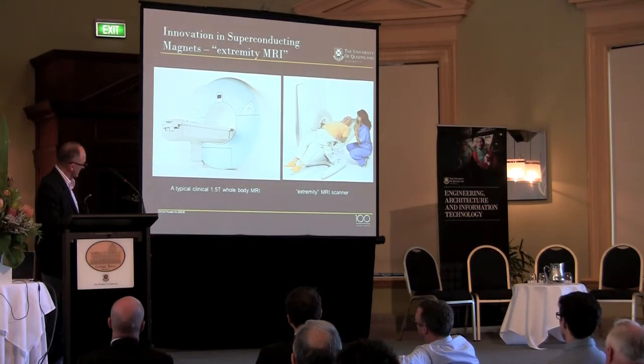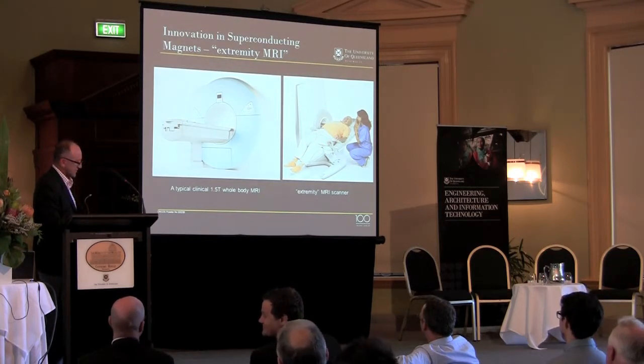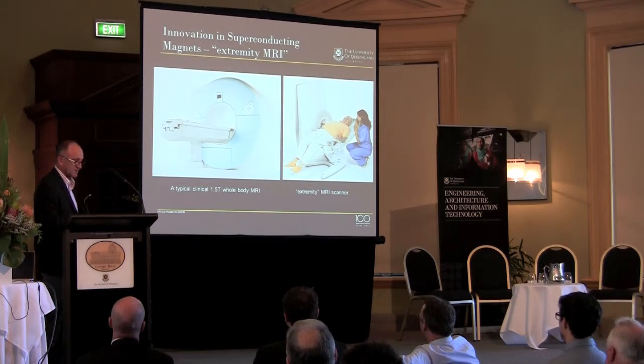So this is an extremity imaging system that images joints in the body, and you can see it's a much more pleasant experience. You get a pretty radiographer to talk to you while you're having a scan, which is always a good thing. Whereas lying in this is quite a claustrophobic and a loud experience. So we at UQ designed the superconducting magnet in this technology together with Magnetica. That's been licensed now through a Japanese colleague to General Electric, who've installed 220 of these worldwide to date.